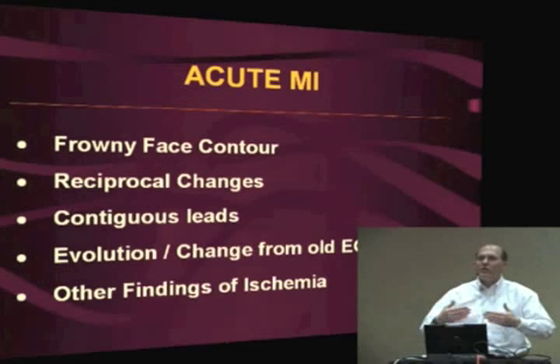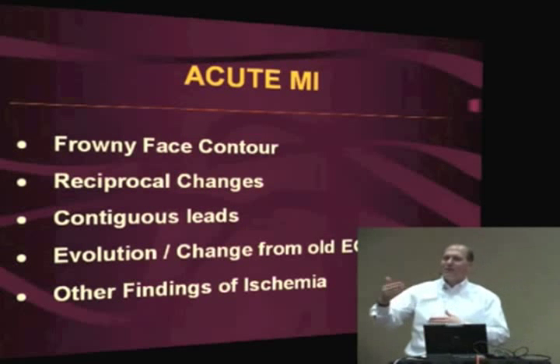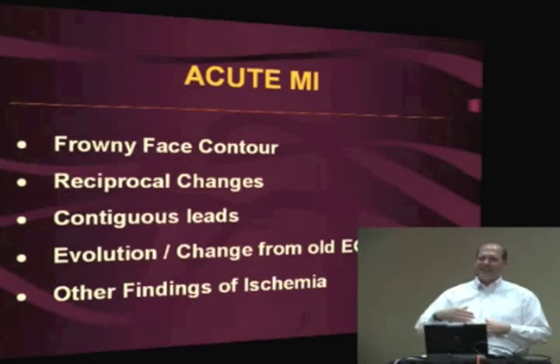If you have any questions, you can repeat it, but remember, repeat it pretty quickly, because if you have it repeated in 3 hours and it did evolve and then they sat there for 3 hours, that's not good for anyone's health, your own or the patient's. And then look for other findings of ischemia.